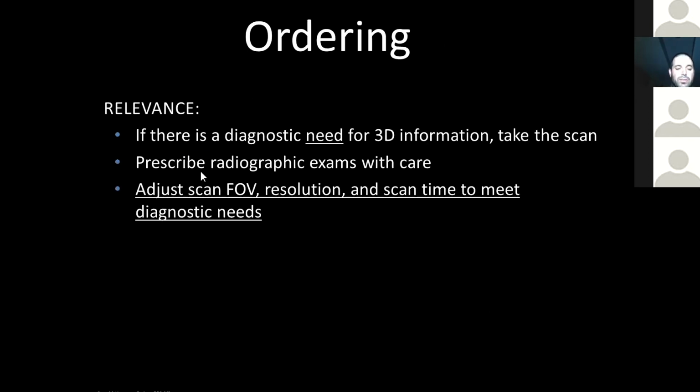You do have to prescribe radiographic exams with care, again, because there is, even though it's low, a risk, a cancer risk associated with use of x-rays. So adjust your scan field of view, resolution, and scan time to meet those diagnostic needs.